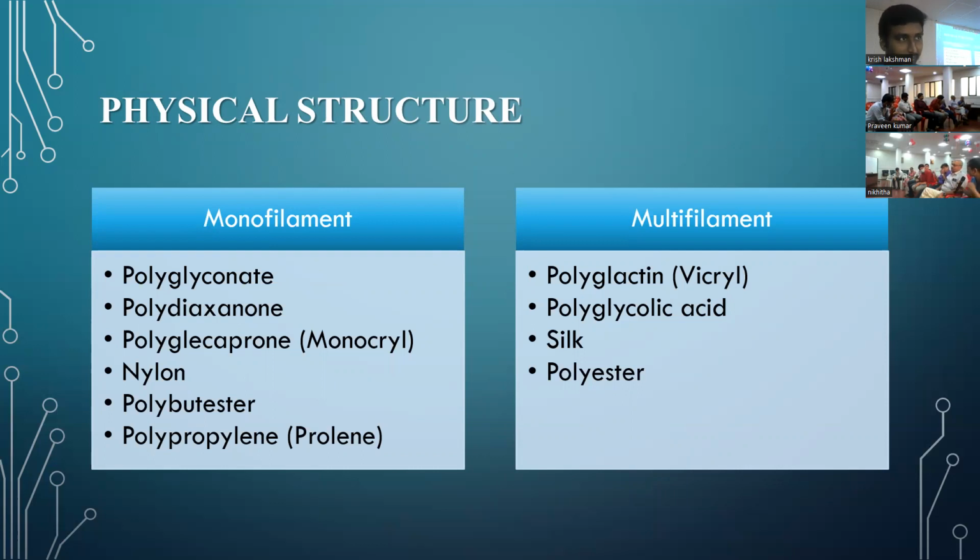45 is the length, in centimeters. That is different. This is the diameter. It's called USP. Does anyone know what USP stands for? It's basically from the United States Pharmacopoeia. They start with 0. 0 is the center. Anything above that becomes 1, 2, 3.